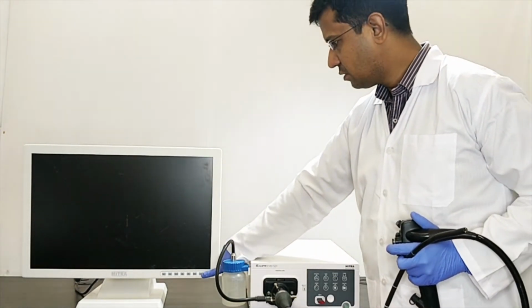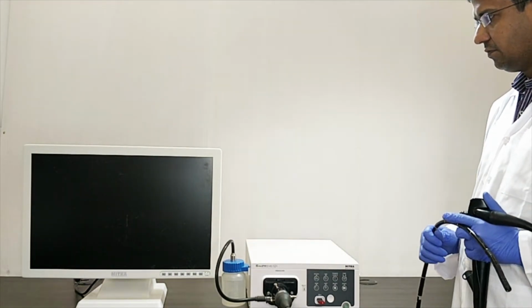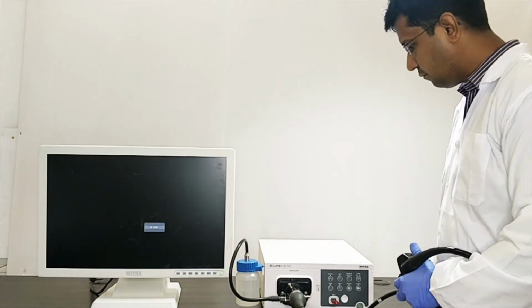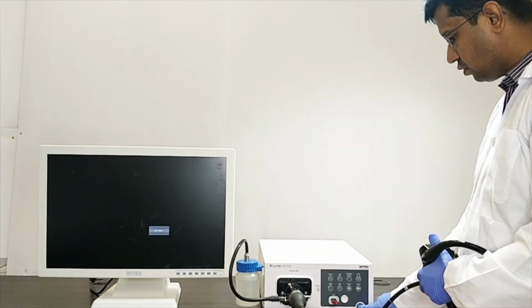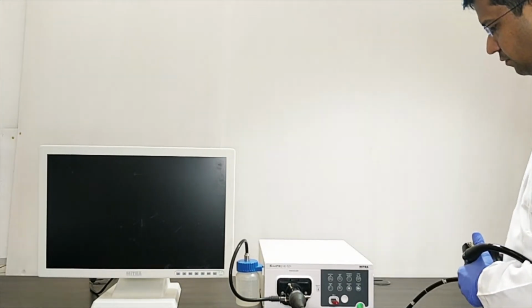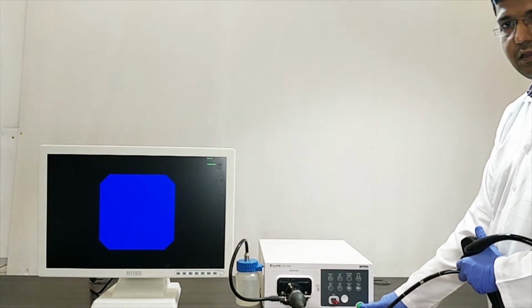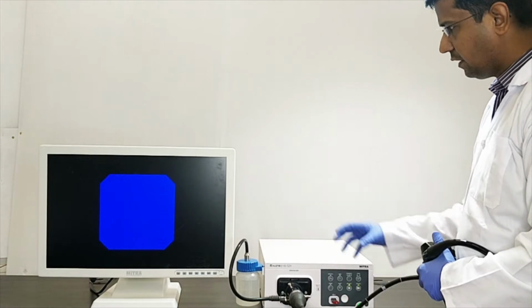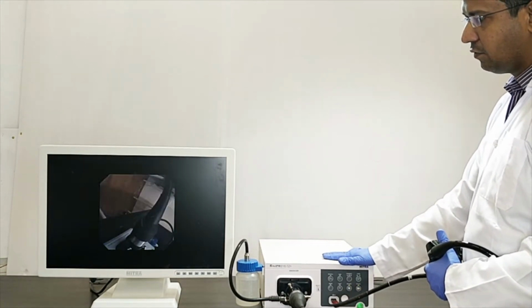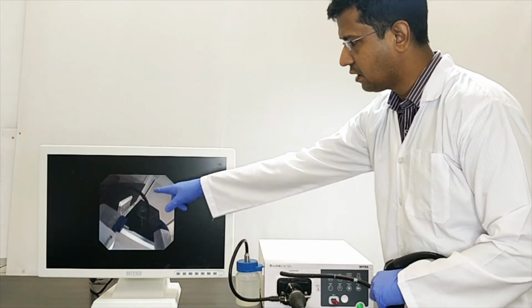I am switching on this monitor. Now I am switching on this video processor. To switch on the processor, you have to press the power switch. The green LED glows. It takes 4 to 5 seconds to boot and start this video processor. You can see now the image mask has come.